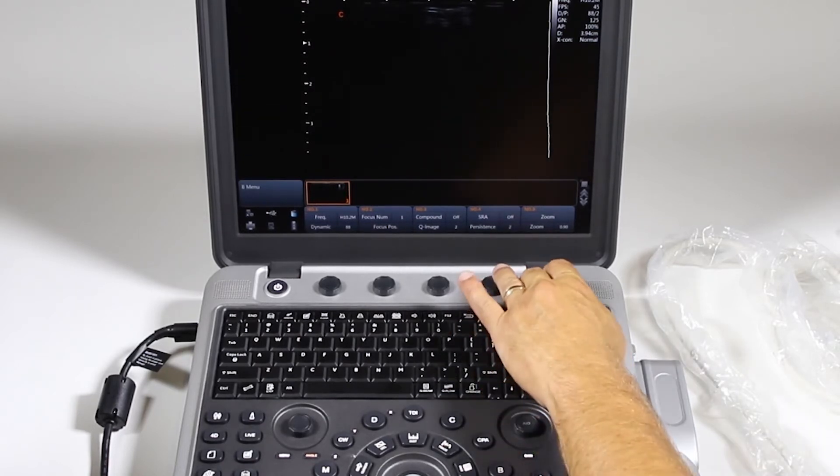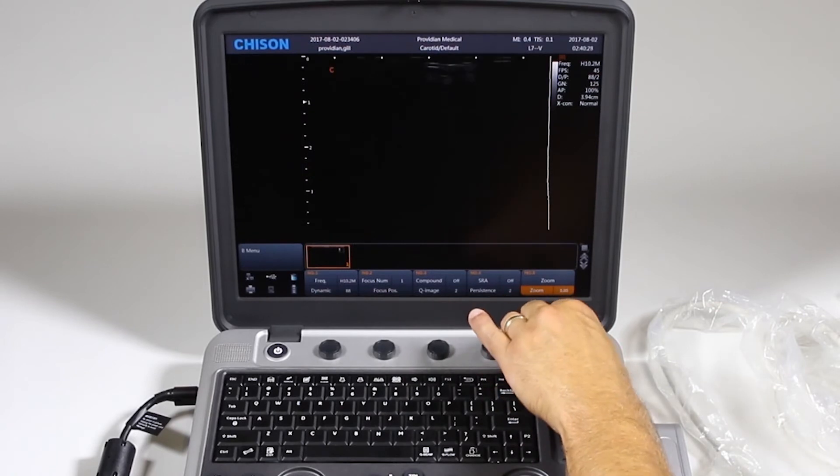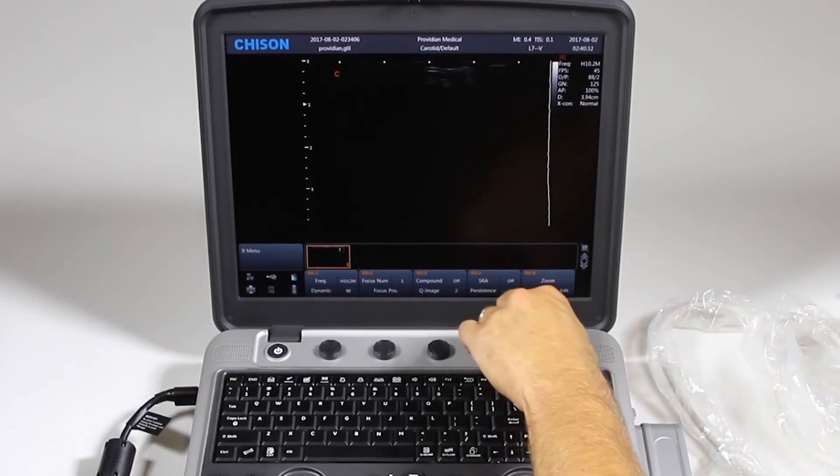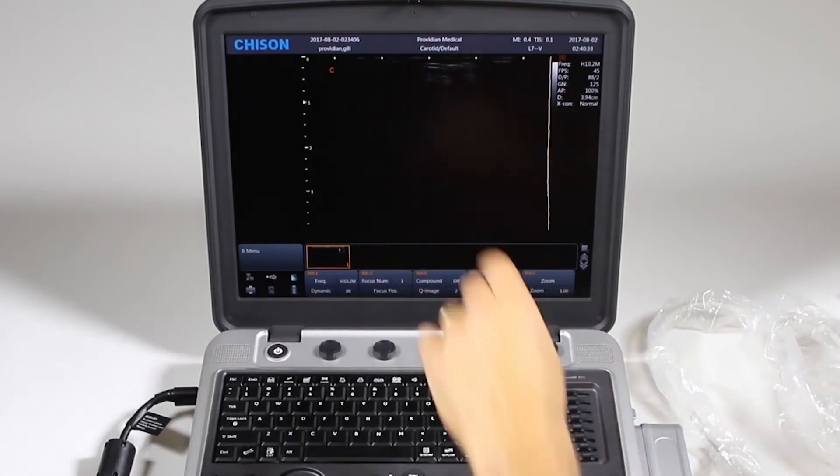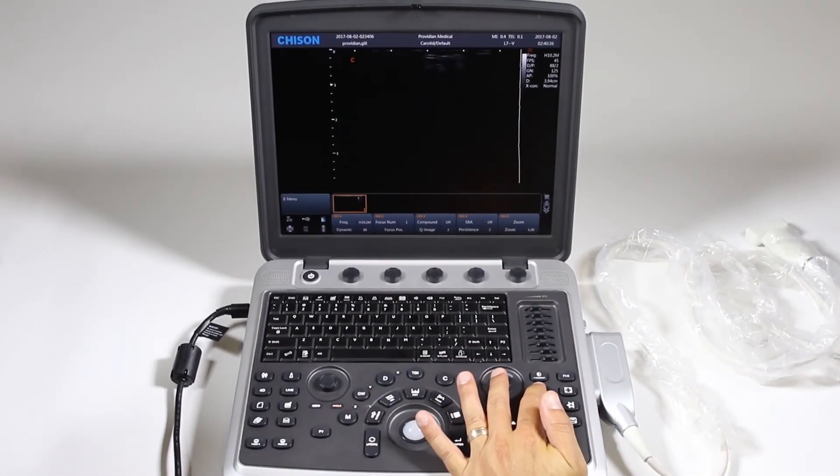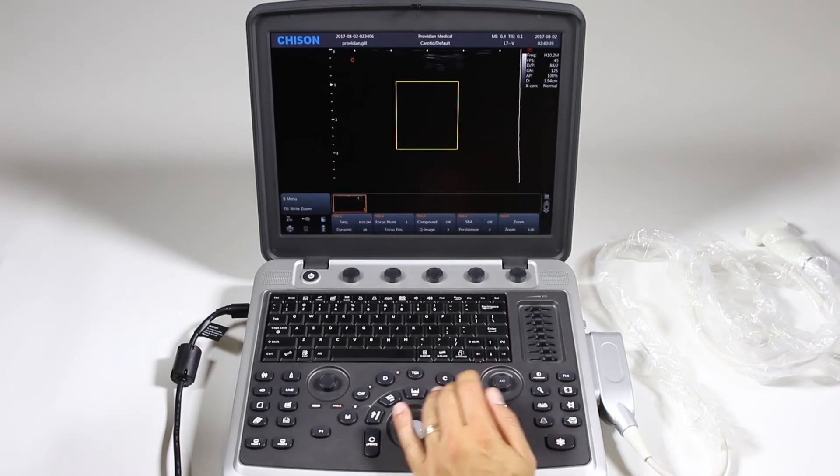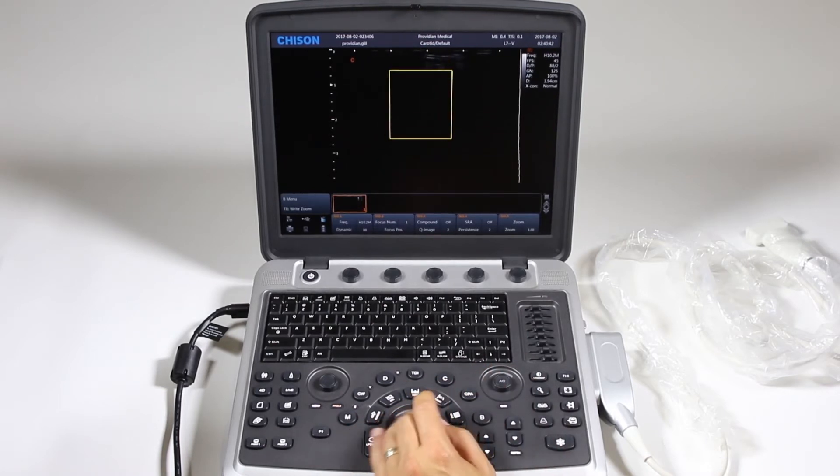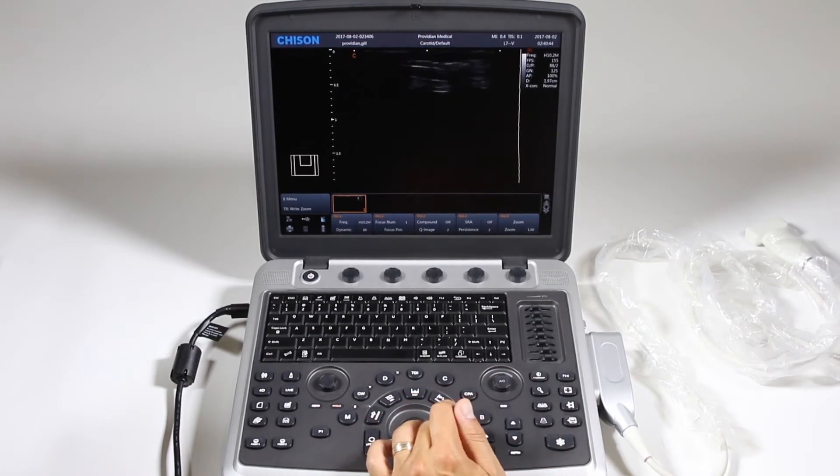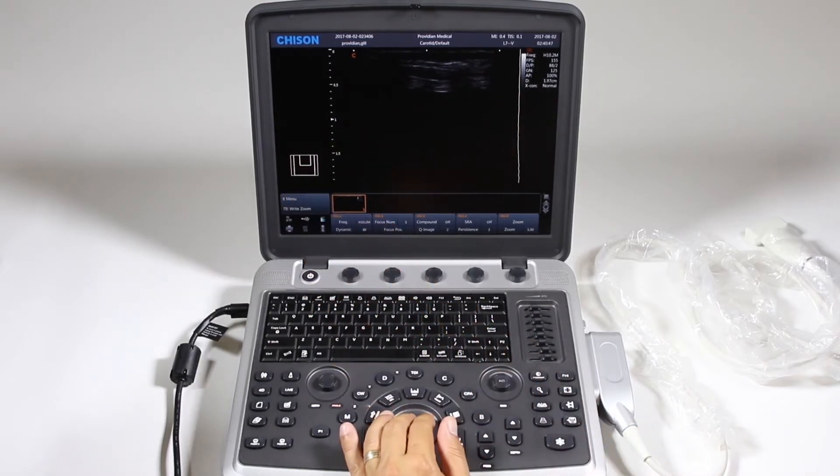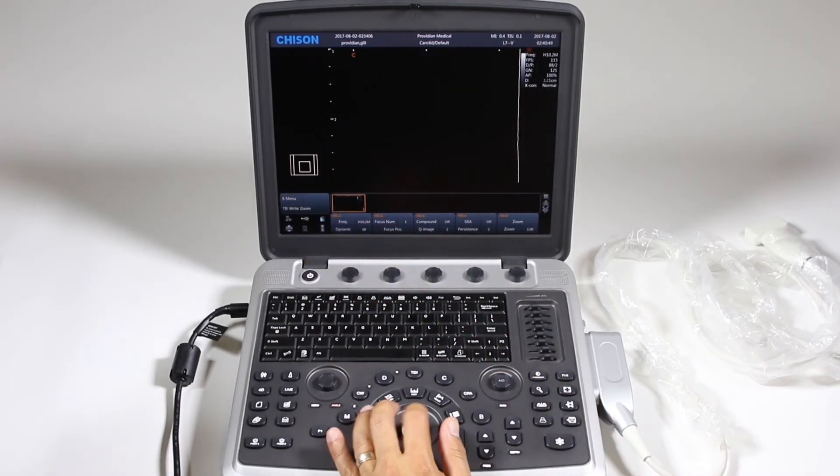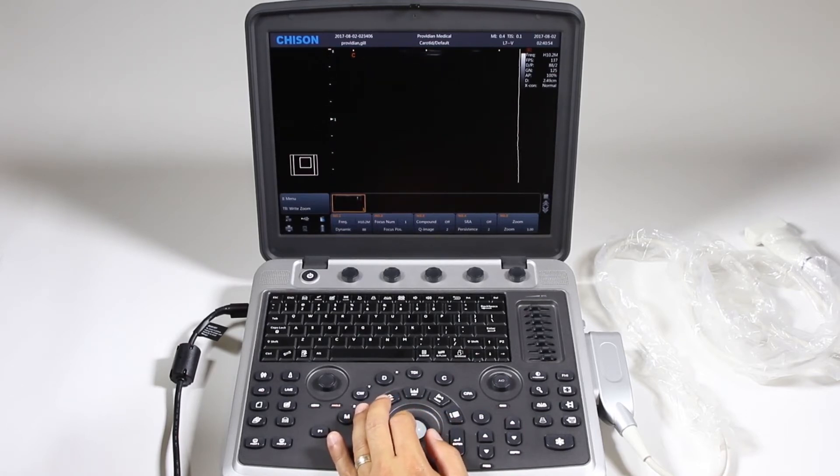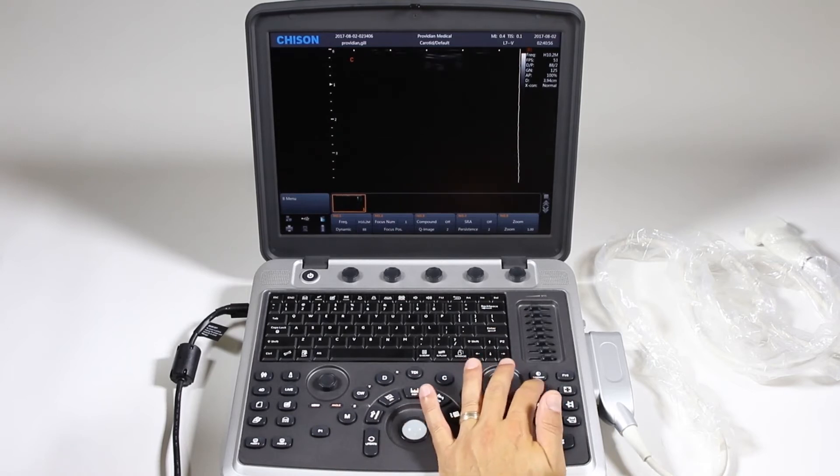Now here we have zoom. And this is just a simple zooming the screen, and you can see how the image changes. This is just that general area. You can also use this zoom down here. And this zoom will give you a region of interest box. And you can scroll that around and find the place that you want. You'll click enter, and this is going to show you where exactly you're zooming. And you can move this around to different parts of the anatomy to change your zoom box. Okay, I'm going to get out of that, but one more thing with that.